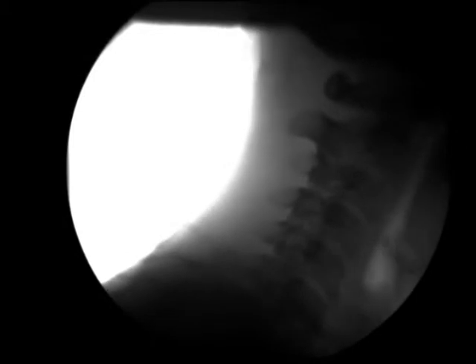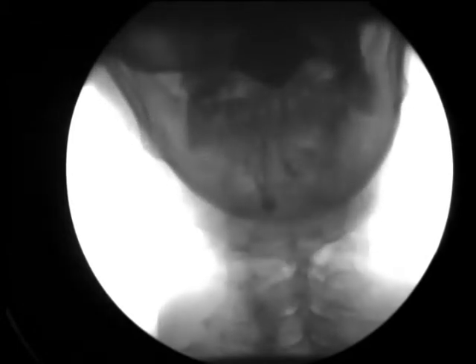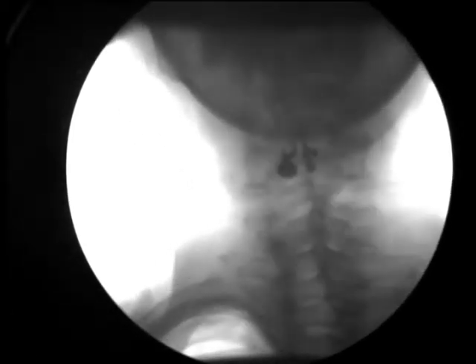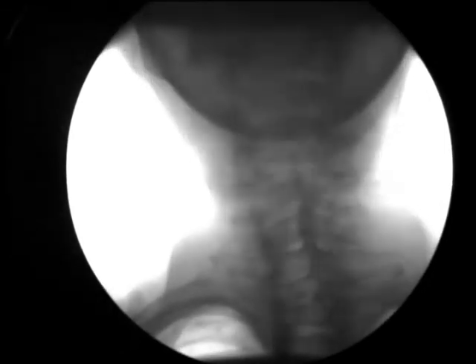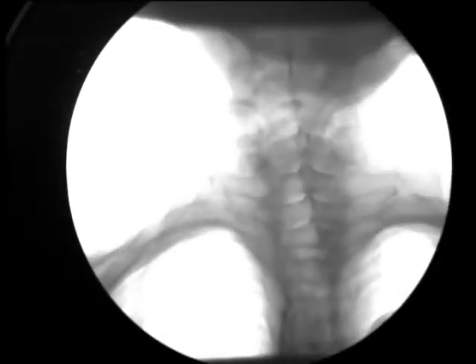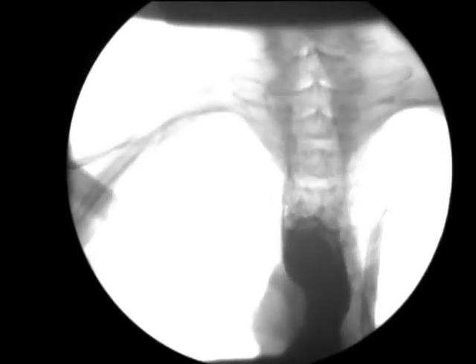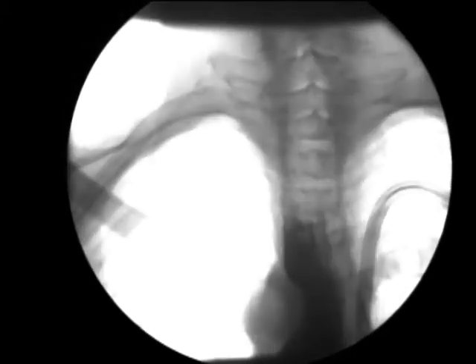and the fact that a PEG tube was placed with no diagnosis of what the issue was. Was it swallowing? What was it? And even when we turn her, you'll see that the swallow looks fine. There's really no penetration or aspiration on the lateral view. That was very timely. But you're going to see that the dye is backing up almost to the collarbone here.